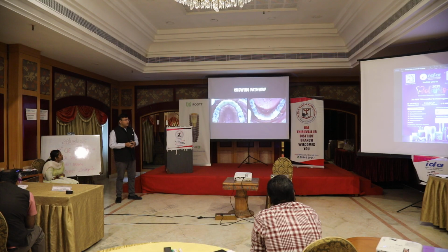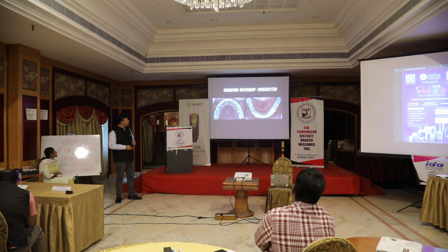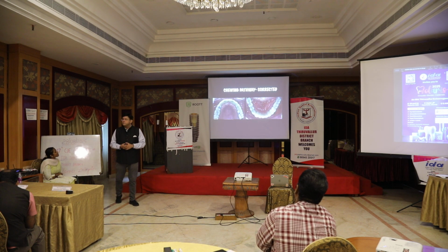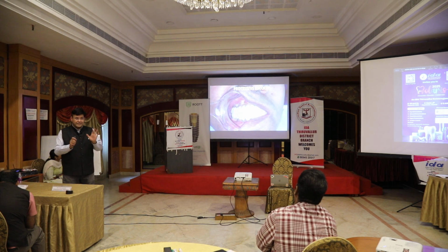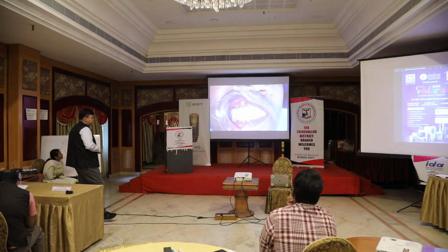Do you see markings on non-functional? In the maxilla also we have a few markings, mandible also we have a few, and now I have reduced them all. This is where I send this patient, in centric. Now let me see what happens in the protrusive.